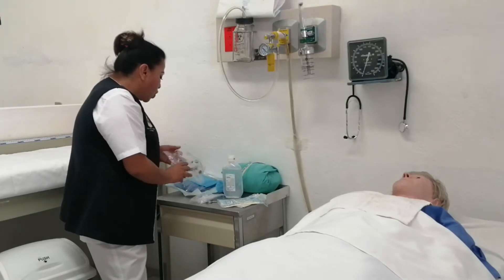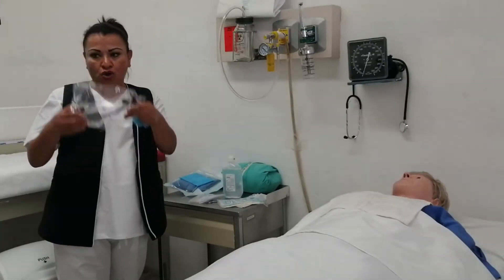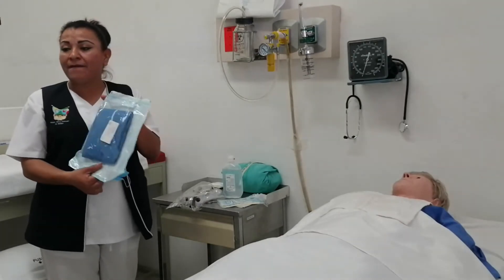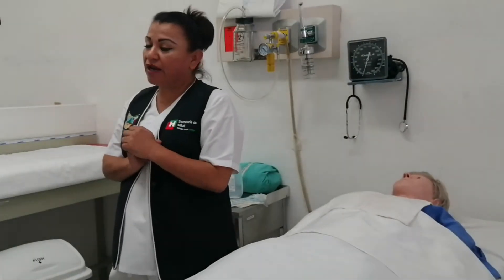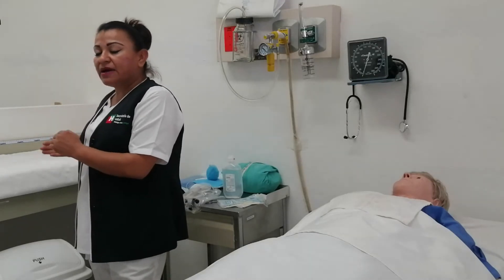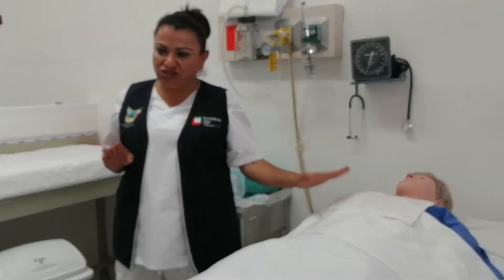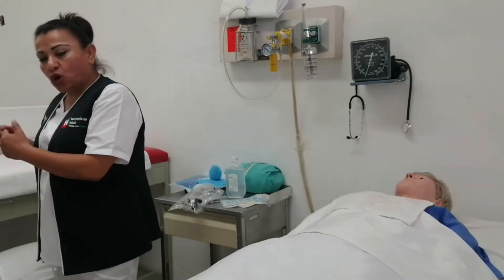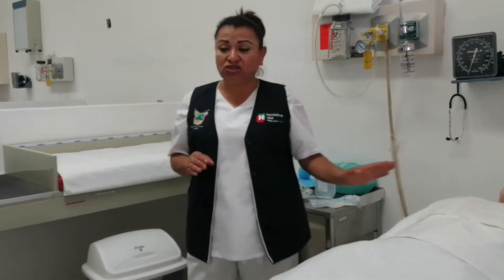Necesitamos contar con un equipo de seguridad: cubrepelo, goggles o lentes, cubrebocas y bata desechable. Necesitamos también nuestro equipo de RPBI, compuesto por un bote con bolsa negra para desechos sin contacto con fluidos del paciente — esta es basura municipal — y una bolsita en color rojo para todos los desechos que tienen contacto con secreciones o fluidos del paciente.